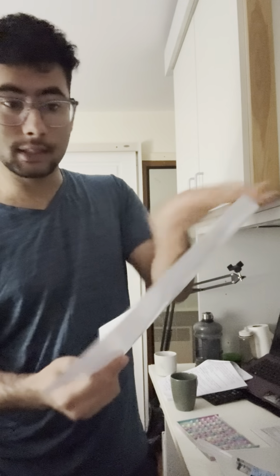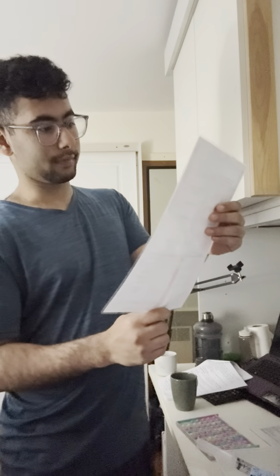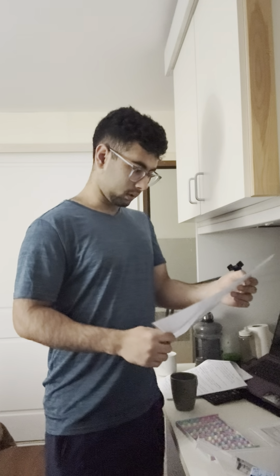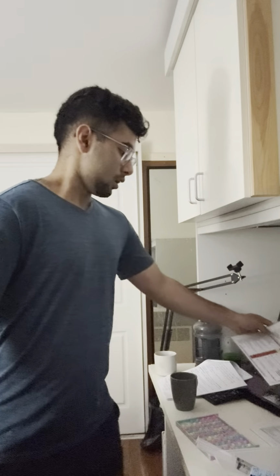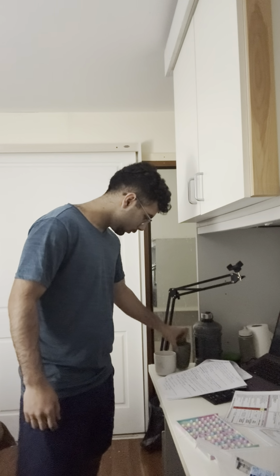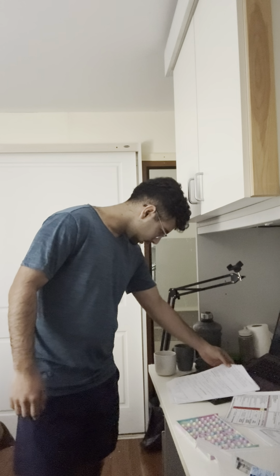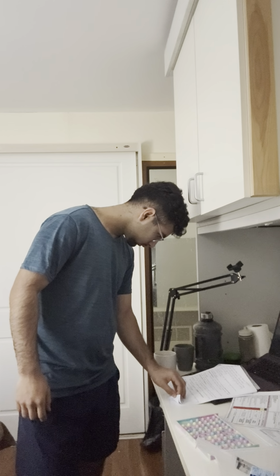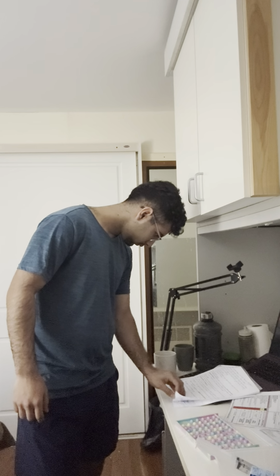We check if there is any kind of problem including this area, and we're going to fill it up as well. So we note the indication. If there is an indication, the VIP score is 0, and the date, time, and birth of the patient as well. Cool, right? So now what we're going to do is calculate those. Now, so we did a recheck, right? We are ready to go.